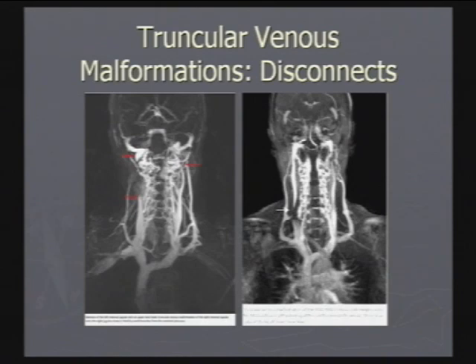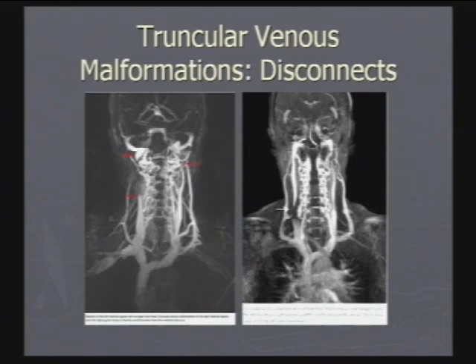Plus it of course will demonstrate to you things like the enhancement of the vertebral plexus. So in these two particular cases, these people are lucky. They have very good response in their vertebral system, and they can really carry the blood away well. There are MS patients I've seen where the vertebral system is not well developed at all.